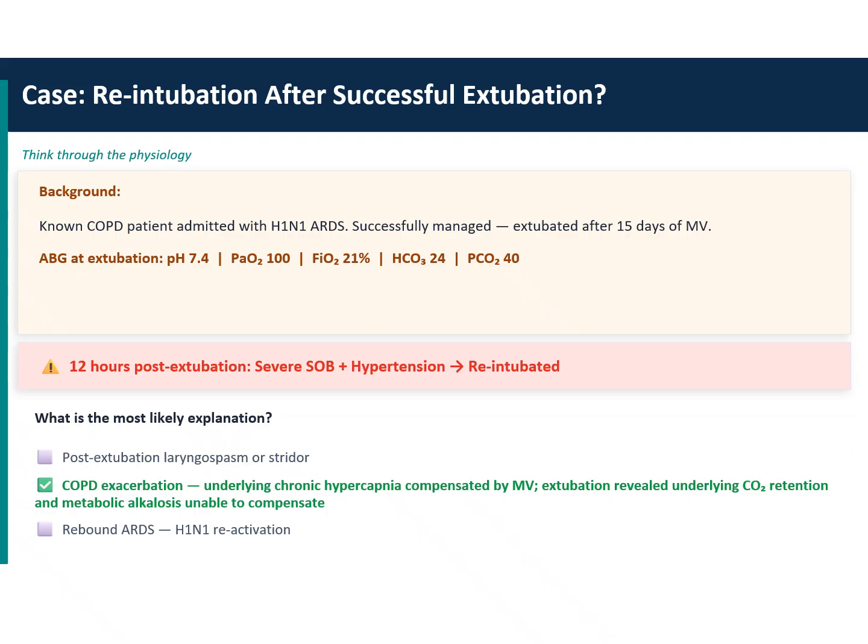Before extubation, we check for any glottic edema. So we do something called a cuff leak test. We deflate the cuff and auscultate, and see how much is the leak. If it is more than 150 ml, we are expecting no glottic edema. A very crude way of looking into it.